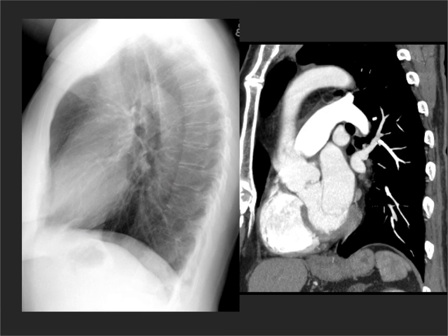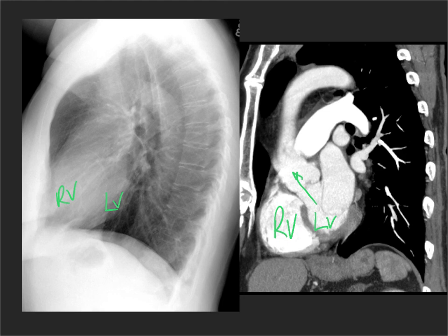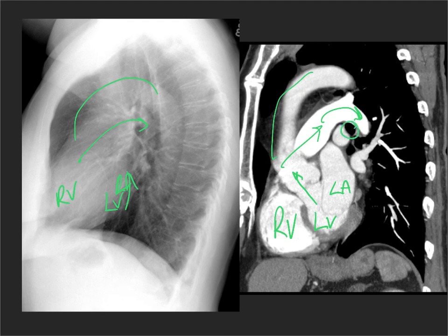Finally, this is a slice from a sagittal contrast-enhanced CT study. Remember that sagittal scans are one slice whereas the chest X-ray is a superimposition of structures. Again, this is the right ventricle, this is the left ventricle — we know that because we can see blood coming out the aorta through the center of the heart. This is the left atrium, the aorta coming across, and the main pulmonary artery leading to the left pulmonary artery. And this little lucency in here is the left main bronchus — the same as we saw on the radiograph.